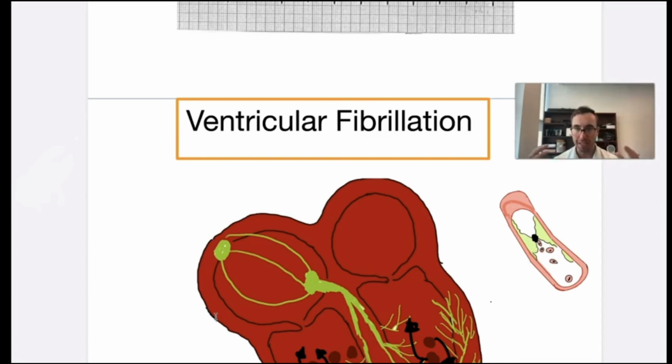And obviously, if you're in a shockable rhythm in the pre-hospital setting, you have a higher likelihood to survive. It's about 20% approximately. However, that increase in coming back goes down after the third defibrillation. So it takes a pretty significant drop. Okay, so if you're in the shockable rhythm and you've had less than 3 shocks, your chance of coming back is around 20%. However, if you have 3 shocks or more during cardiac arrest, your mortality goes up and your chance of survival goes down, obviously. And that's the point of vector change.